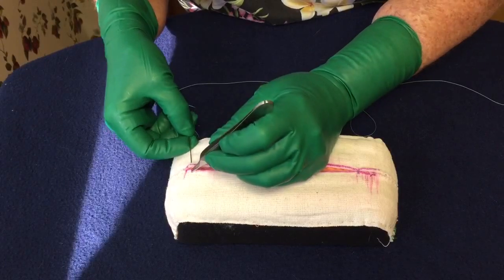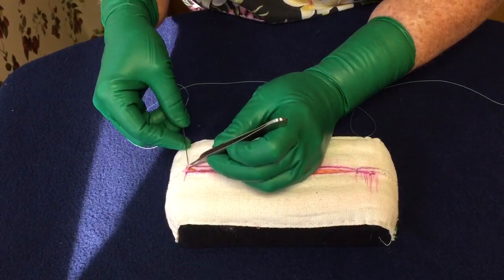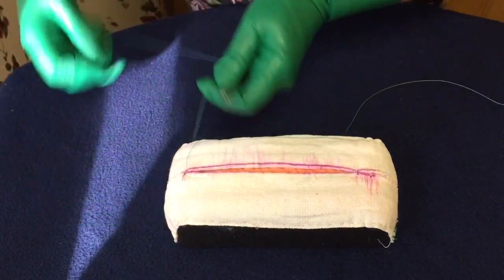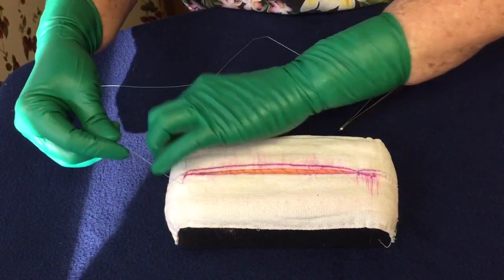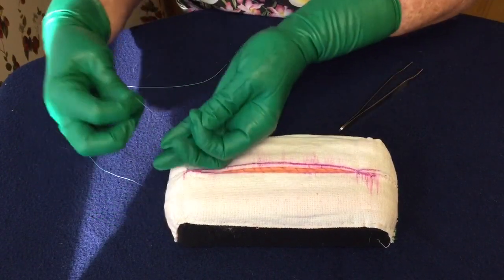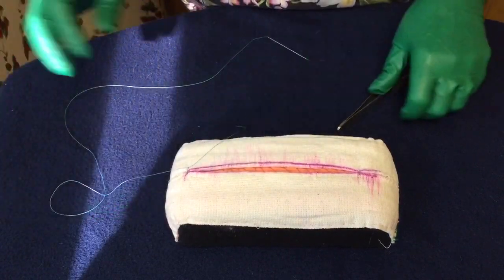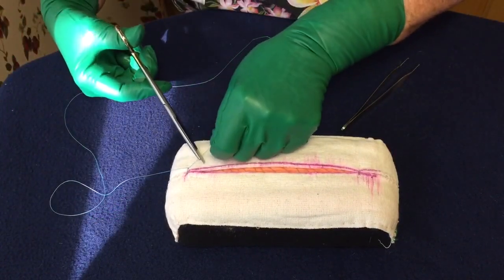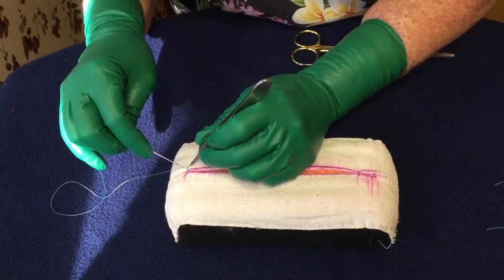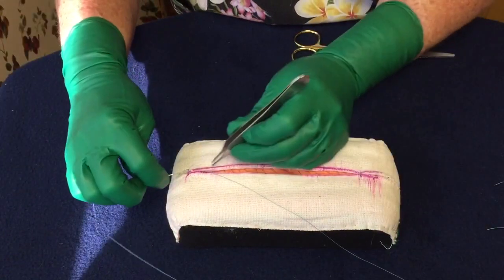The other option you have is doing a simple stitch on one side — you could even do it a little beyond it. Do the simple stitch and tie it. These gloves are really slippery; they're also old so they're not doing too well. You would tie it tightly — not a great tie here because of the slippery gloves. Then you could go in where the knot is and start doing your running subcuticular.